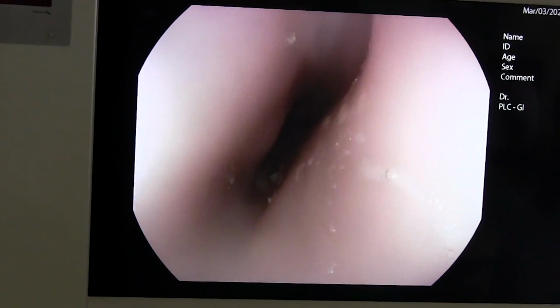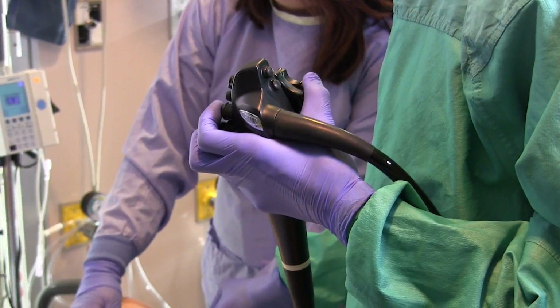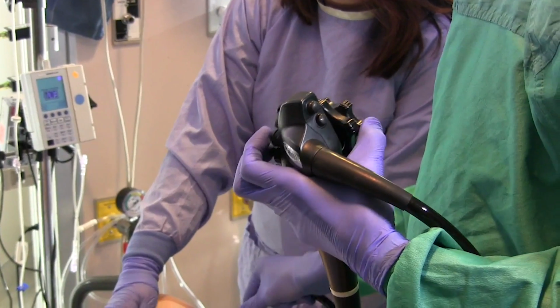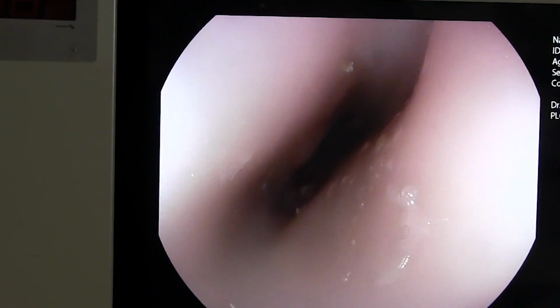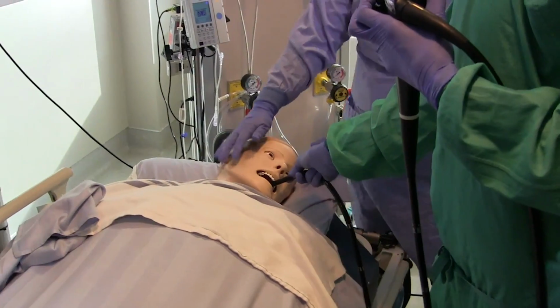And if there were a tumor in this area, then we could obviously visualize it well, and then we can insert instruments through the scope that will come out into our visual, where we're visualizing, and then we can operate with these instruments by manipulating the scope to cut around a tumor and underneath it and remove it in one piece. So from a patient, there's a lot of advantages.